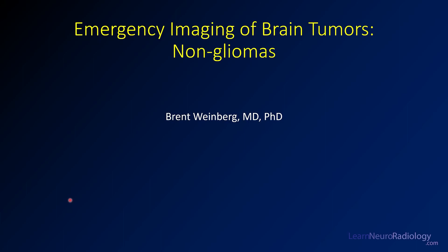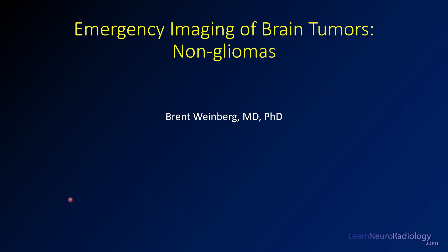We're going to focus on CT findings and how to hone your differential when you see these at the time of presentation. We talked a lot about primary brain tumors in the other videos, but there are a number of other brain tumors or tumors in the calvarium that you can see. We're going to cover meningiomas, metastatic disease, and lymphoma — these are pretty commonly encountered in major hospitals. Calvarial tumors have a special differential, so we'll take a look at those as well.